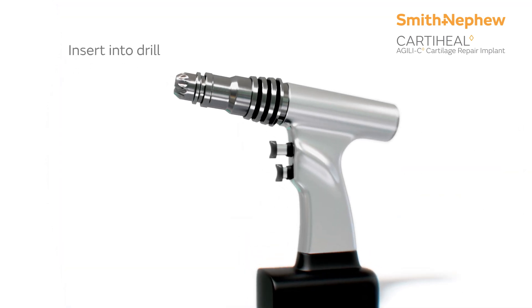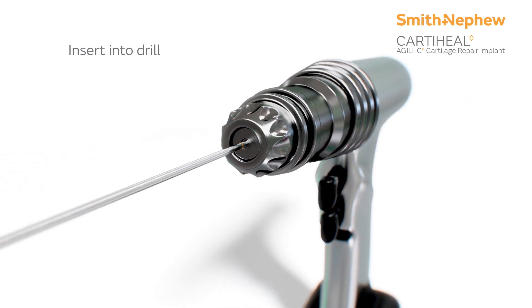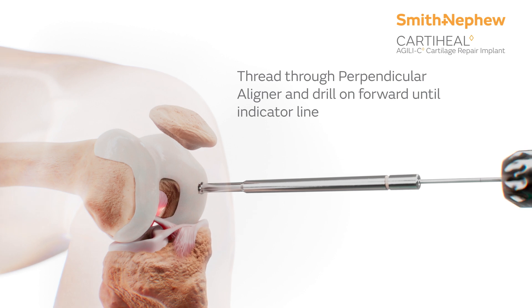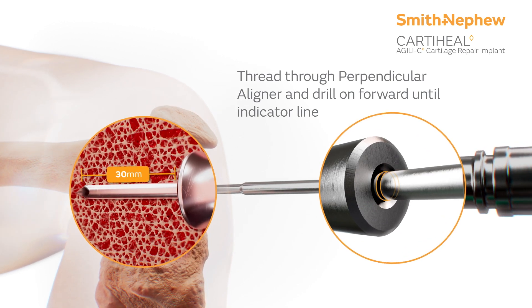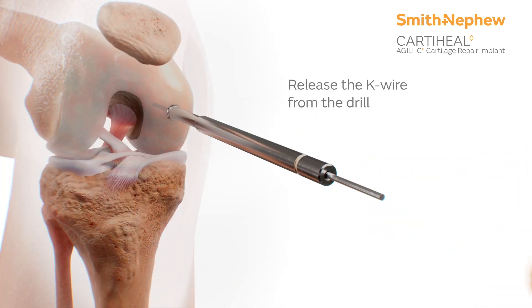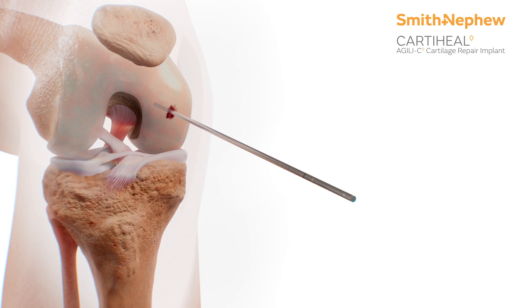Next, place the K-wire in a motorized drill so that the indicator line is visible. Then, thread the K-wire through the perpendicular aligner and drill into the lesion until the indicator line reaches the proximal end of the perpendicular aligner. Afterwards, release the K-wire from the drill. Remove the perpendicular aligner, leaving the K-wire in place.